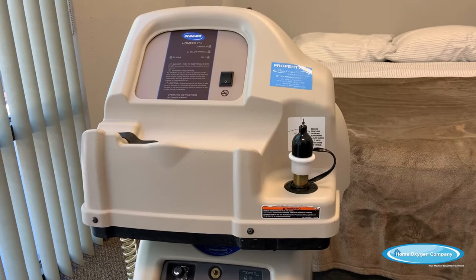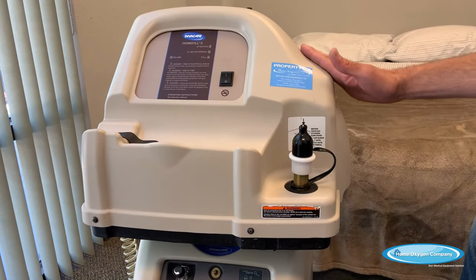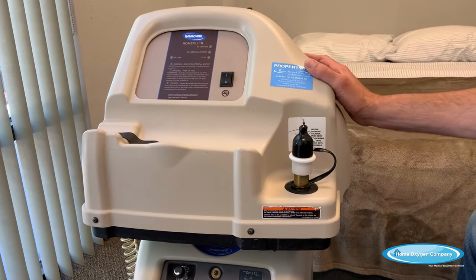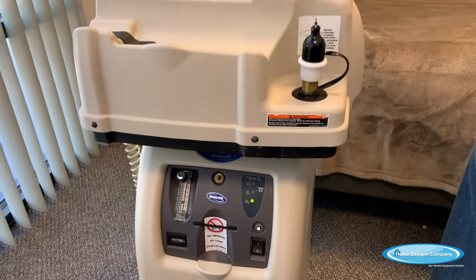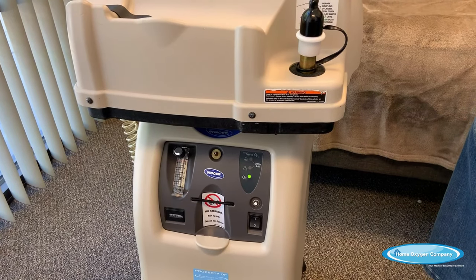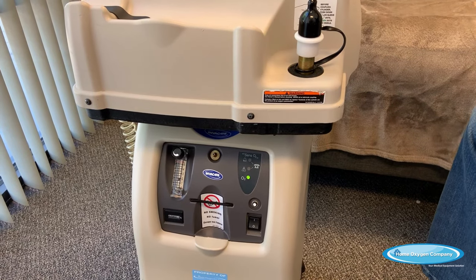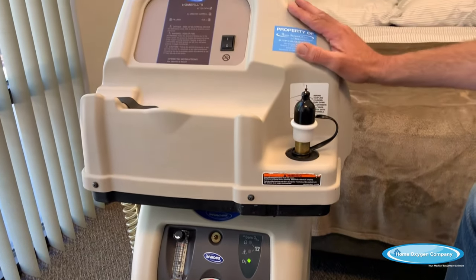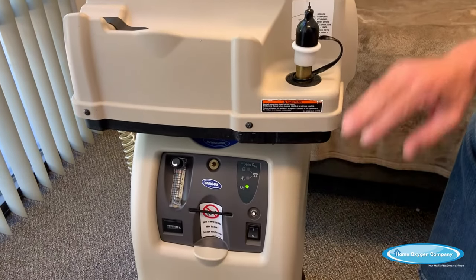Your doctor has ordered ambulatory oxygen for you today. We're going to go over the home fill option, which our home oxygen company offers to all of our patients. The home fill compressor is a compressor that takes oxygen from the concentrator and compresses it into little cylinders that you're able to fill and take out with you for your ambulatory oxygen.